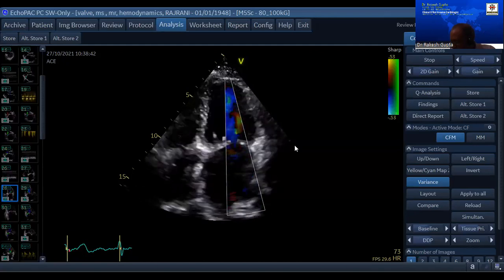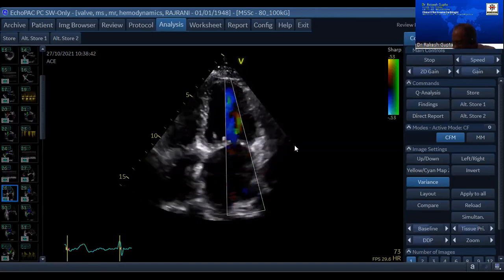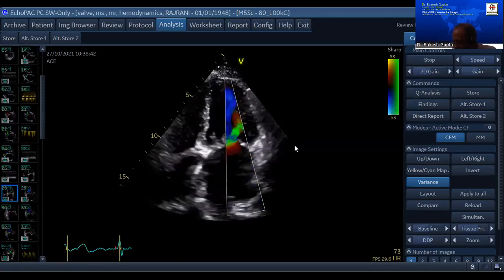Any questions about this MR? I'm trying to look at how simple I can really make it. Any questions? Somebody has got it?